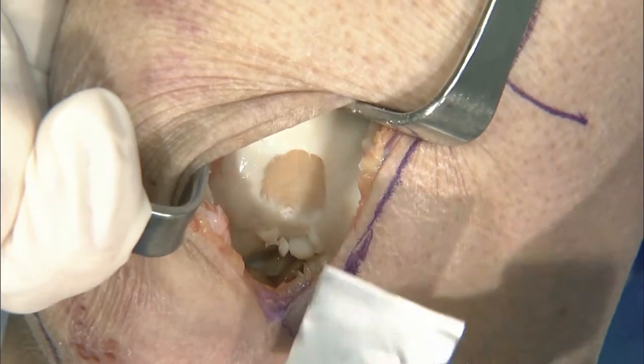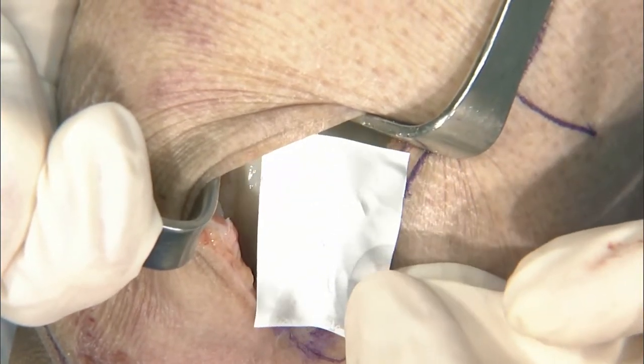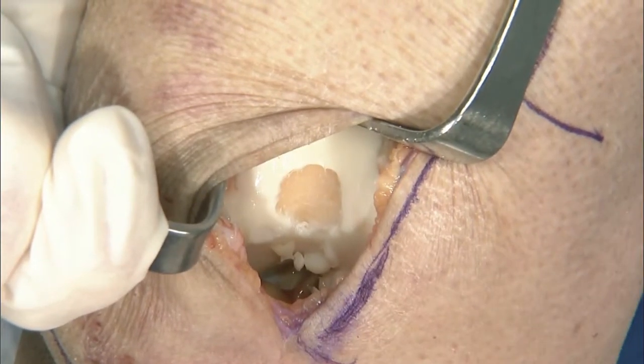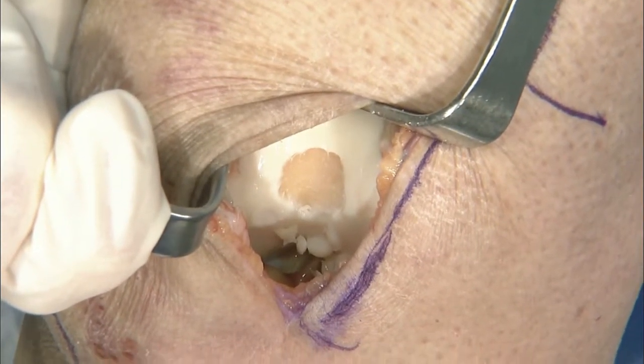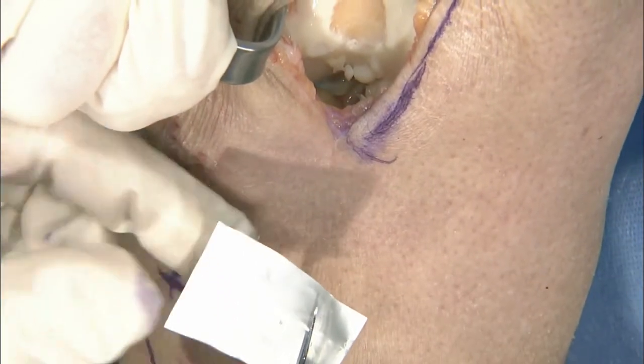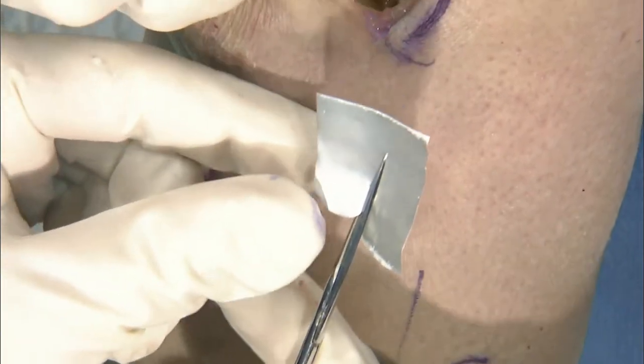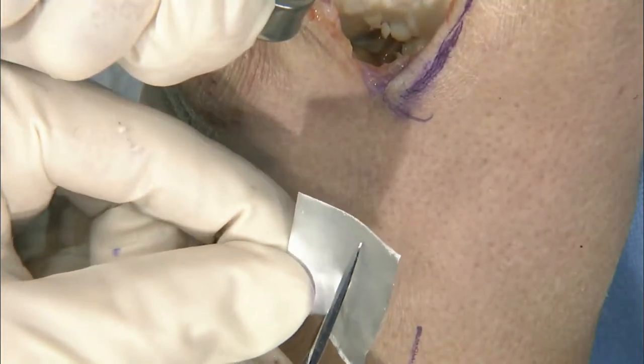Personally, what I do, I will freehand it. I'll bring it up to the size, I get an idea where my size is, and then I'll make it just a little bit larger than what I think the actual defect is so that I can trim it down in certain areas where it needs to be trimmed down.